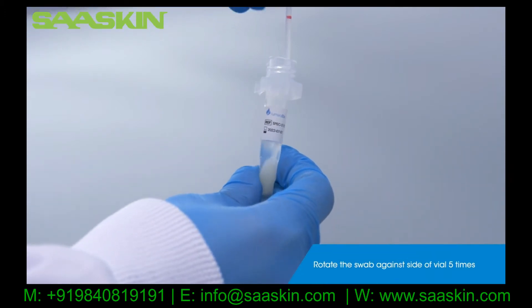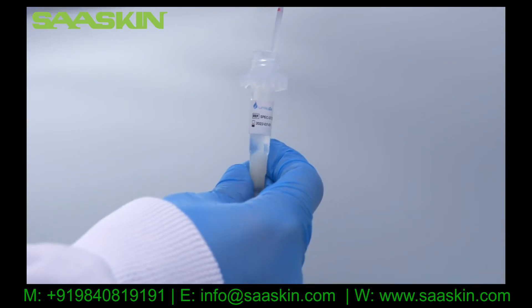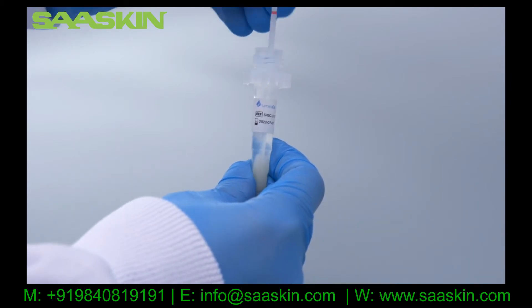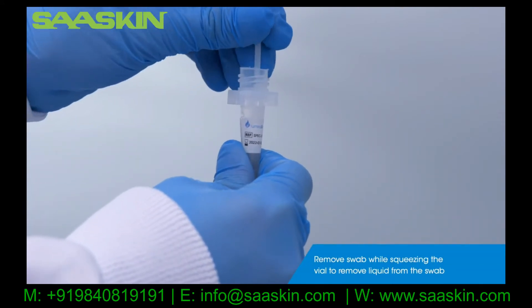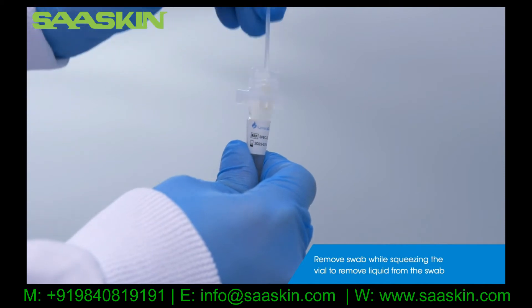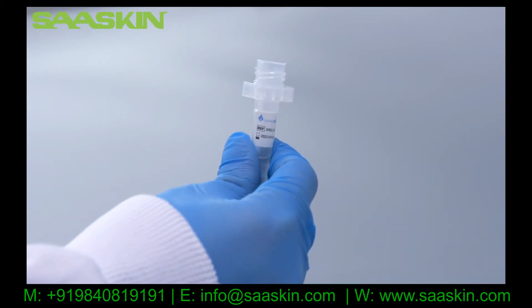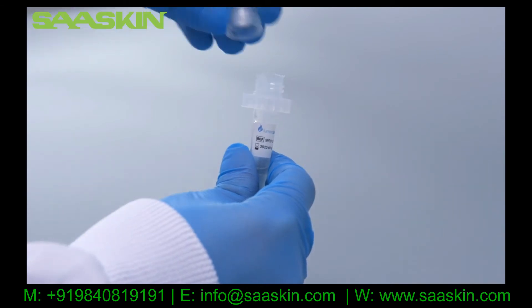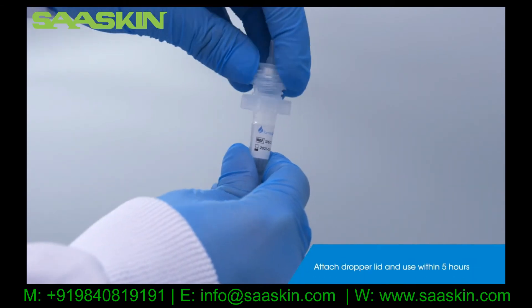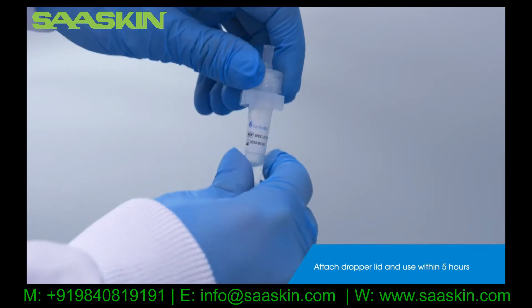Stir well by rotating the swab against the side of the vial 5 times. Remove the patient swab while squeezing the vial to remove the liquid from the swab. Attach the dropper lid to the extraction vial. Extracted samples must be used within 5 hours of preparation.